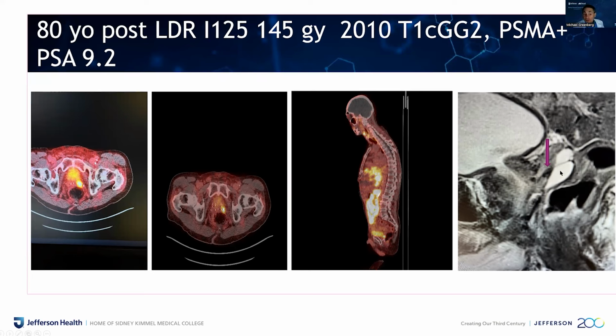And on the 4th slide, which is the MRI, you see the target, which is the dark black area that the arrow is pointing to. And that's the current area that the PSMA PET scan is showing us. And you see the balloon underneath. Well, it's not a balloon. It's the hyaluronic acid. It's the gel that I was able to shape like a balloon-like structure. It's very soft, and you can just define that gel just to that area.